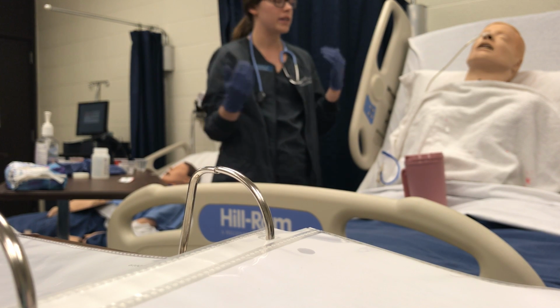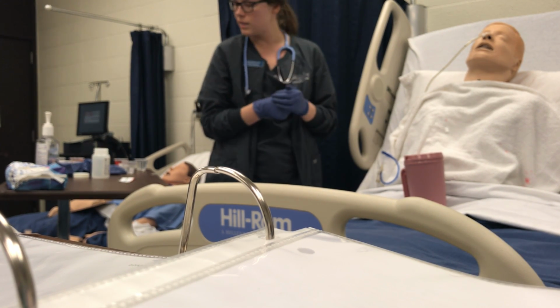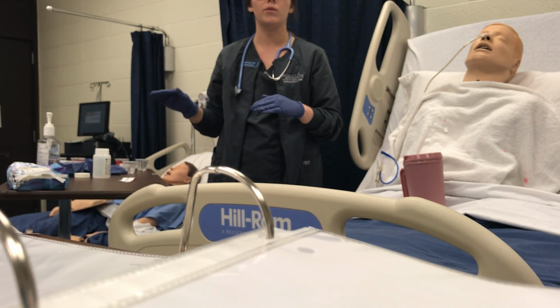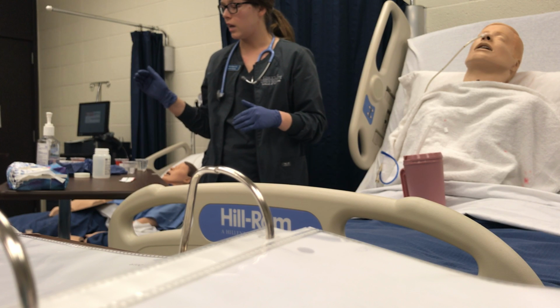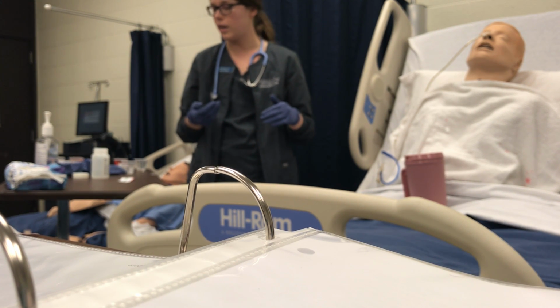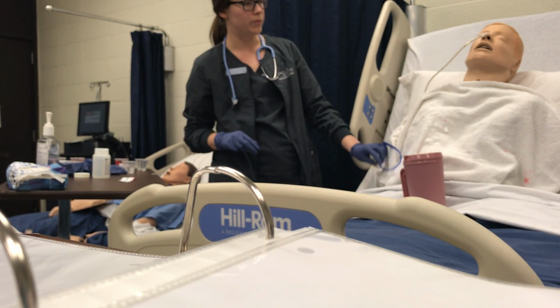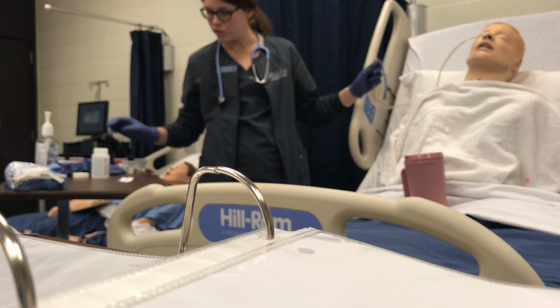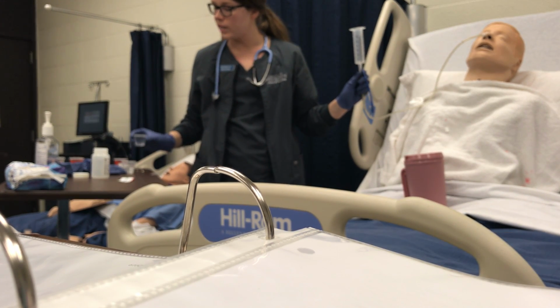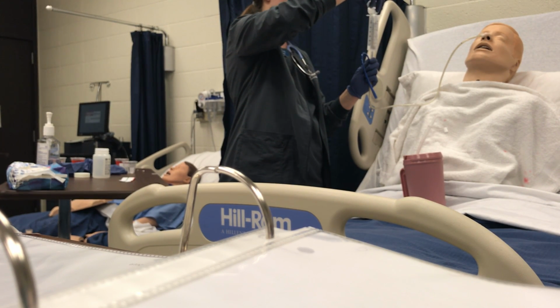So I would come in, I would ask him his date of birth again, just verify that he is who he is. And I would also have done my 2 checks already on my medications. I would have made sure that they were okay to be crushed. And once I knew that they were okay to be crushed and they were good to go, I'd be ready to administer the medications. And before I got started, you would need to flush the tube with the piston syringe here. And before each medication, you would do a 20 to 30 ml flush.